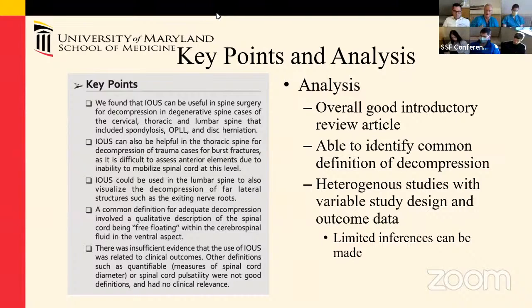And since you used the R word, I have a follow-up question, the radiology word. Who does these in their review? Is this a surgeon-driven technology that's used, the modality, or is this radiologists who come into the OR and then run the ultrasound? Yeah, so it kind of is varied. At least at our institution, it's really all driven by neurosurgeons. However, in the papers, it varied based on the way they describe the methods. So in some papers, just the neurosurgeons evaluating qualitatively what they saw intraoperatively. A few of them did actually have radiologists come in and independently review the imaging, but it's a little varied. Thank you.